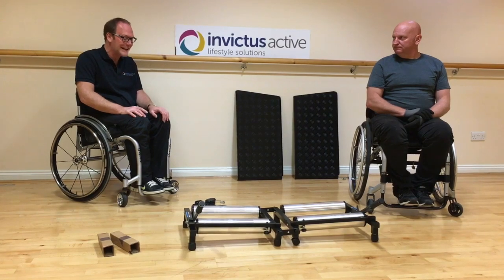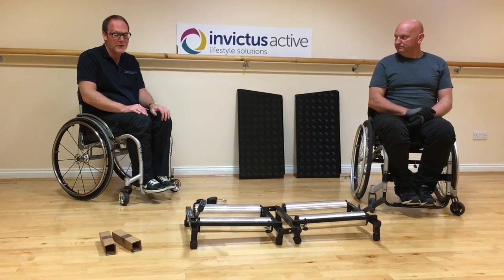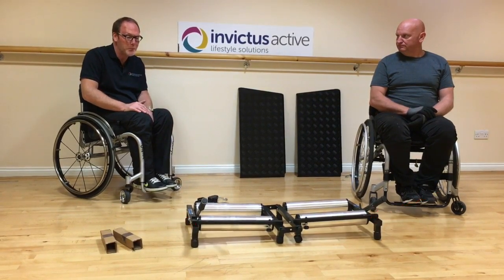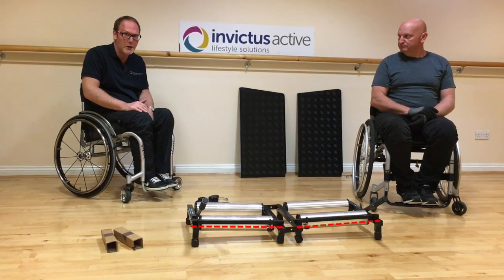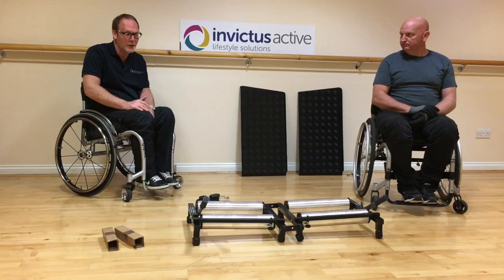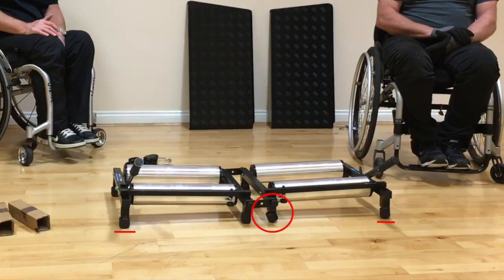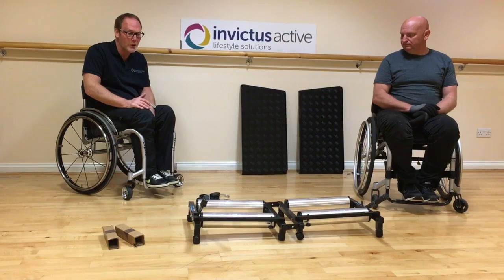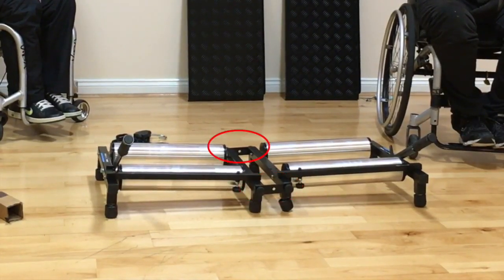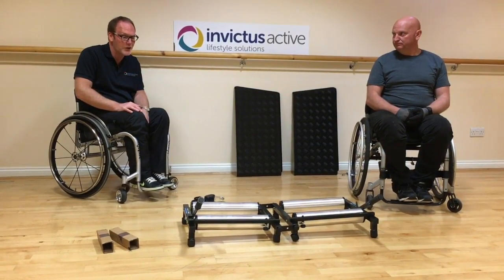Having opened the trainer out, the next thing we're going to do is fit the cabina. To do this, we need to identify the front of the trainer — this is recognisable because there's a bar at the front and no bar at the back. Next, check that all feet are fairly square and sitting on the floor, then tighten up the four thumb nuts, which are the two at the front and the two at the back.